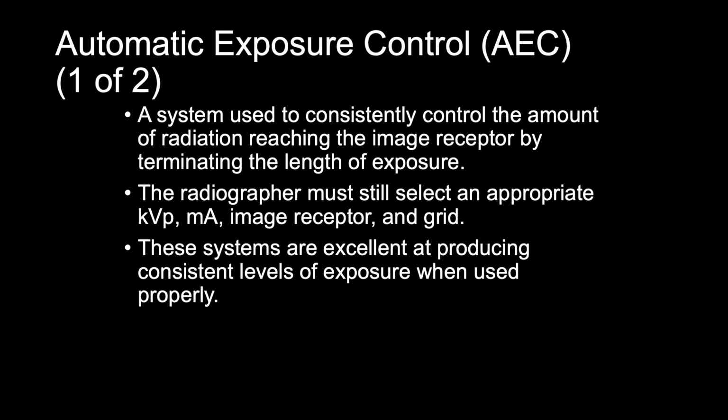Technique charts make it easier for us too. They have technical factors on there, and it allows it to be more manageable to pick out the technique that we need for each exam and the different sizes of our patients. But there are always patient factors that require your assessment and your judgment.